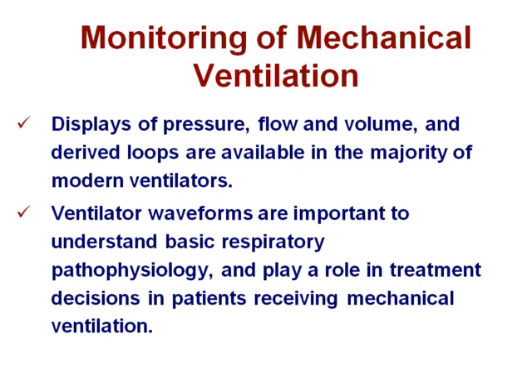Displays of pressure, flow, and volume and derived loops are now available in the majority of modern ventilators. These loops and waveforms are important to understand basic respiratory pathophysiology. We as clinicians must understand what's going on and play a role in treatment decisions in patients receiving mechanical ventilation. So look at the patients and look at the waveforms at the same time. Thank you very much.